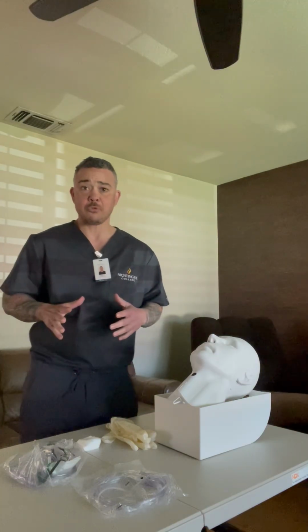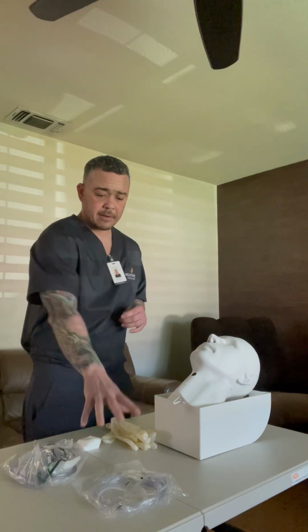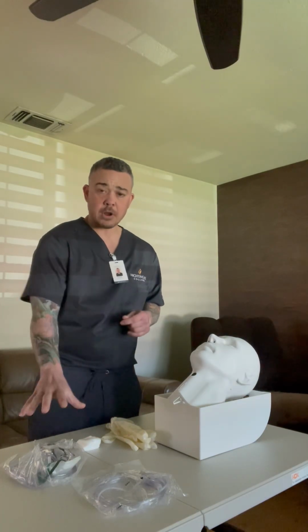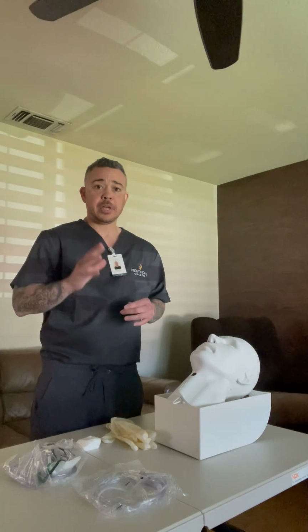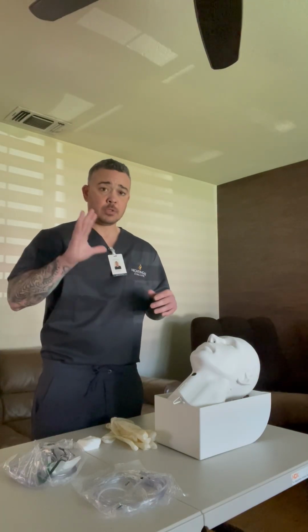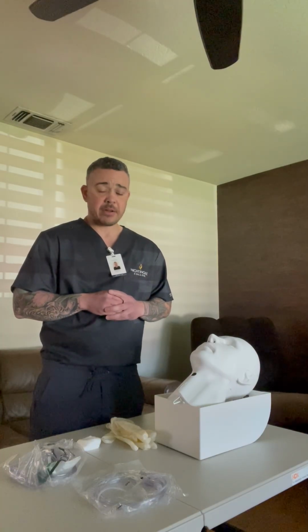I want to make sure I have all of my supplies needed for this skill video, and I have the nasal cannula, I have the non-rebreather mask, gauze, and gloves. Okay. First thing I'm gonna do is make sure when I walk into the room, the door is closed or the curtain is pulled to make sure there is patient privacy.